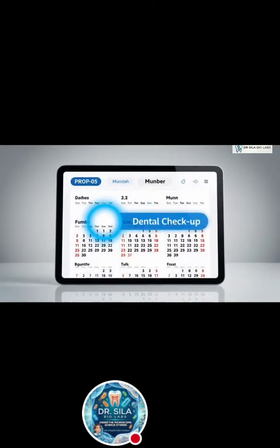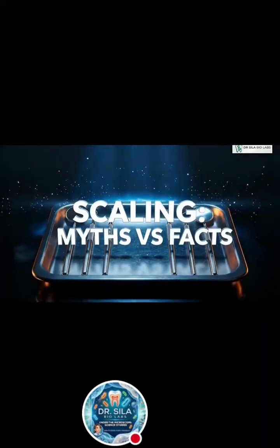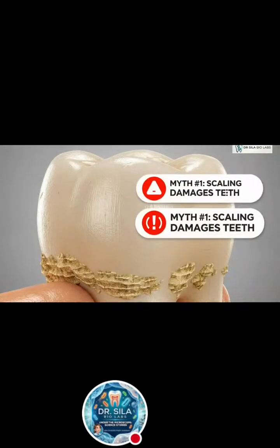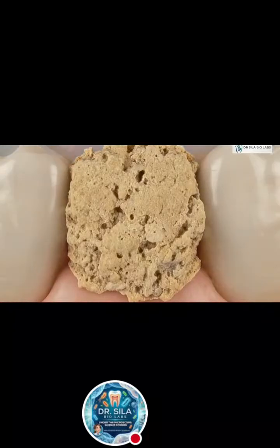Regular dental examinations remain an essential part of prevention. Despite being one of the most common dental procedures, scaling is often surrounded by myths and misconceptions. Let's separate fact from fiction. Professional scaling targets plaque and calculus, not your enamel. The instruments are designed to remove disease-causing deposits while preserving the tooth beneath.